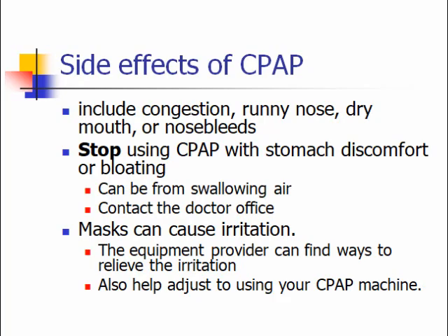That gentle little CPAP pressure that's applied to your airway does have some side effects. This can include congestion, runny nose, dry mouth, or even nosebleeds, especially if you're not using humidity with the CPAP pressure. If you start feeling stomach discomfort or bloating, stop using your CPAP. You may be swallowing air. That pressure is slipping down into your esophagus. Contact your doc, the one that ordered the CPAP, and talk to them about this problem.